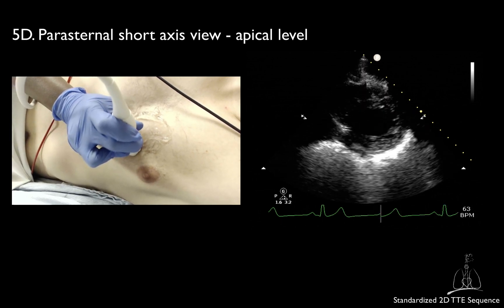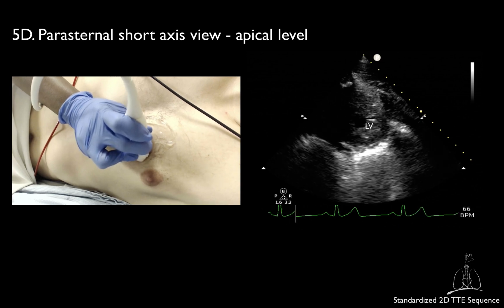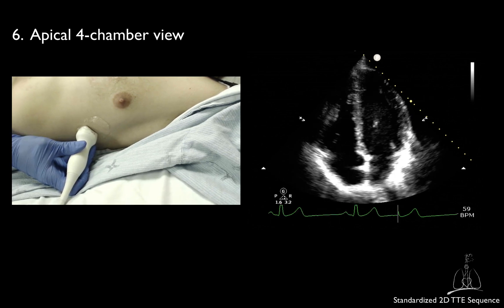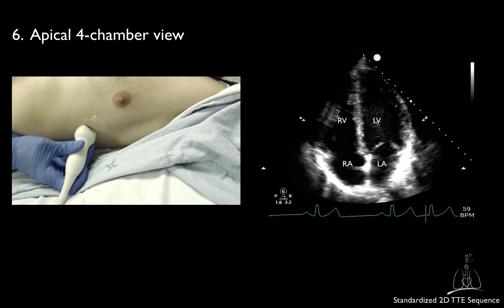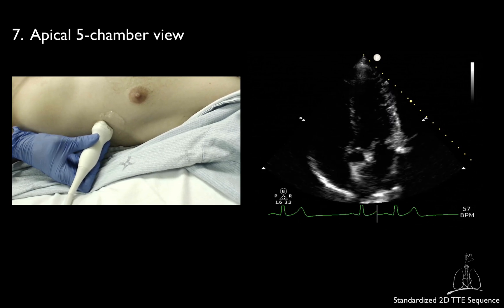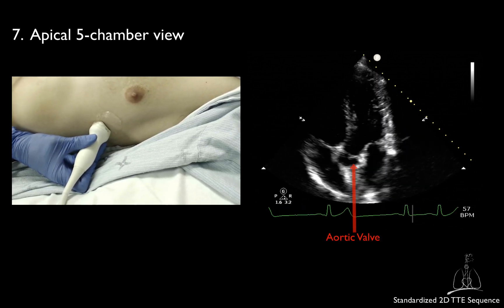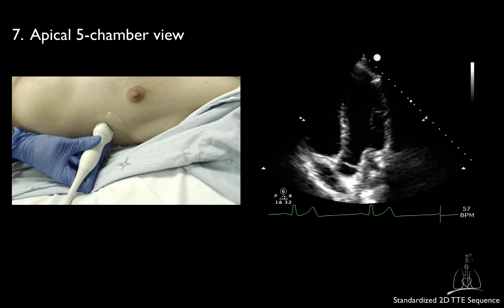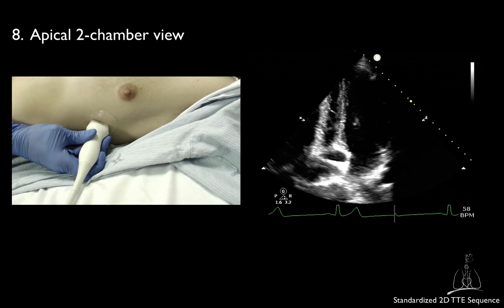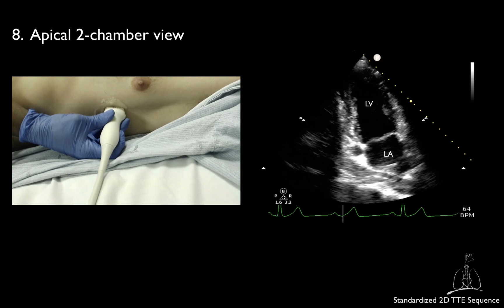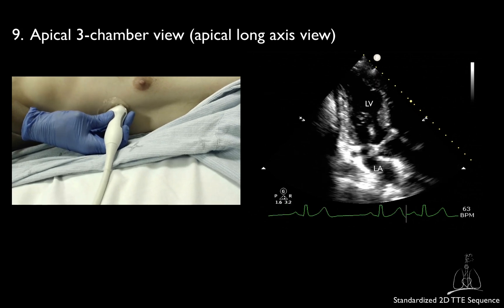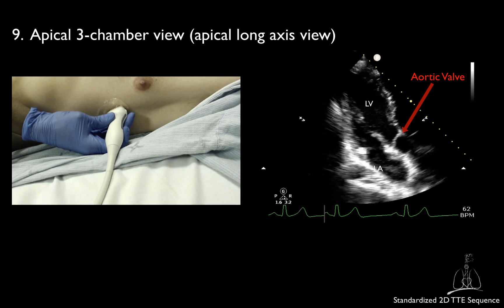And the parasternal short axis view at the apical level. After completing the parasternal views, you will move to the apical window starting with the apical 4 chamber view. From the apical 4 chamber view, you will then obtain the apical 5 chamber view. The next step will be to obtain the apical 2 chamber view. From this view, by increasing your rotation counter-clockwise, you will be able to obtain the apical 3 chamber view, also called the apical long axis view.